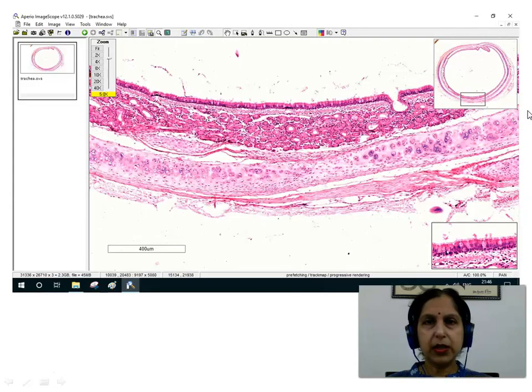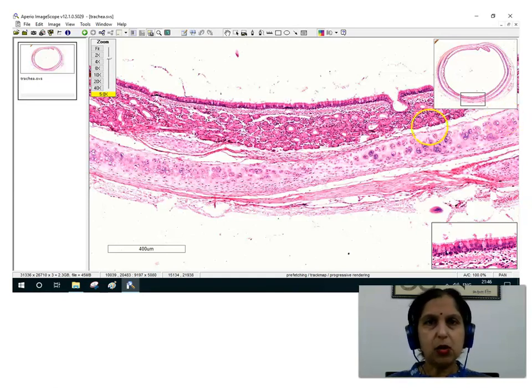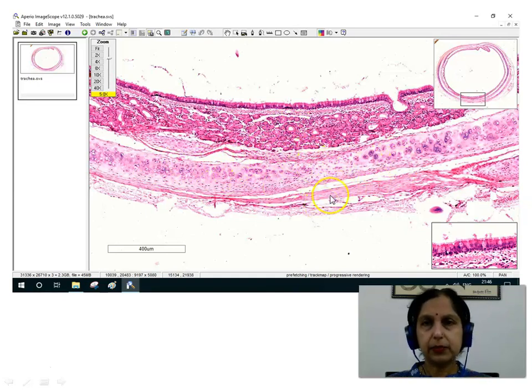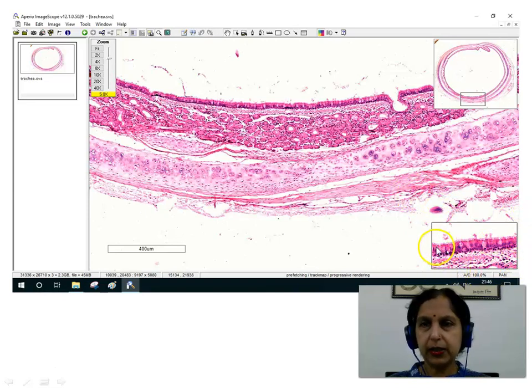We also see an Aperio ImageScope picture of the trachea. We see the lining epithelium, the lamina propria, the submucosa with the acini and the ducts, the hyaline cartilage, and the adventitia. A magnified view of the mucosa shows the pseudostratified ciliated columnar epithelium with goblet cells, which are clearly seen as goblet-shaped cells having an empty cytoplasm.